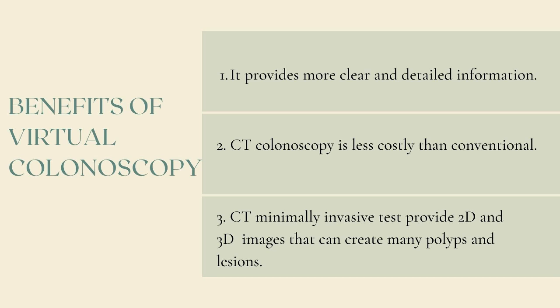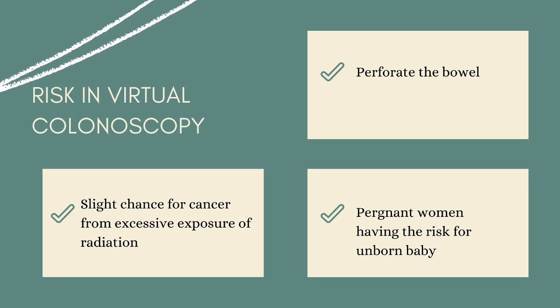No radiation remains in a patient's body after a CT examination. CT colonoscopy is well tolerated. Sedation and pain relievers are not needed, so there is no recovery period and you can return to your normal daily activities immediately after the test. This minimally invasive CT test provides both 2D and 3D images that can show polyps and other lesions as clearly as when they are directly seen by conventional colonoscopy. These are the benefits of virtual colonoscopy.